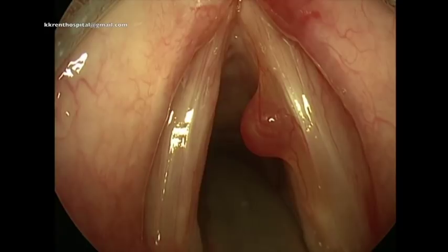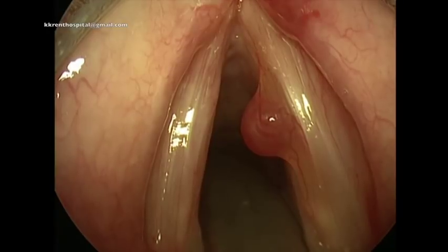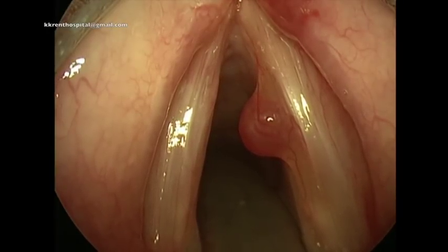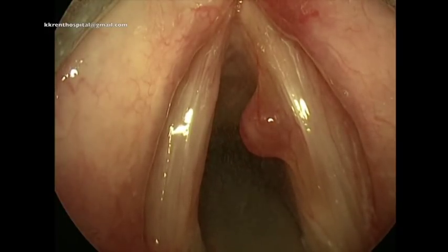This is a patient who has a large pedunculated mass arising from the right vocal cord. This patient is being taken up for surgery under general anesthesia.